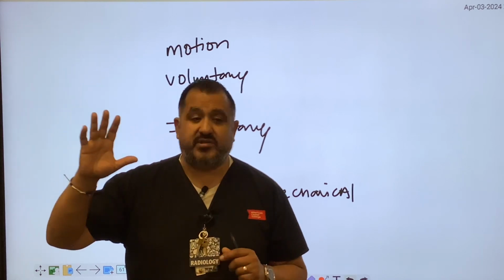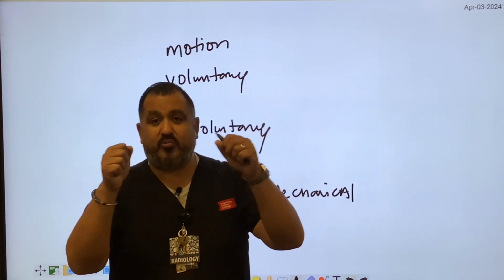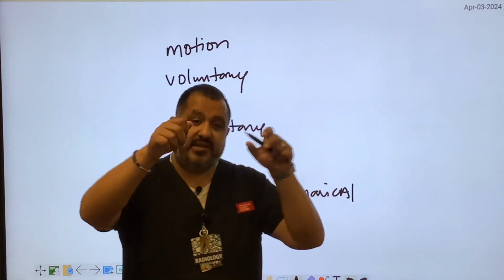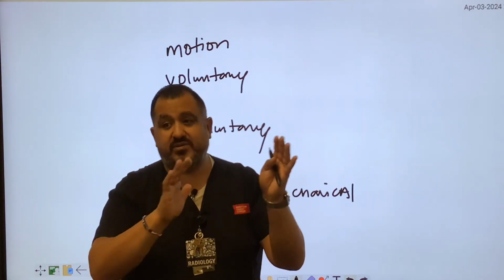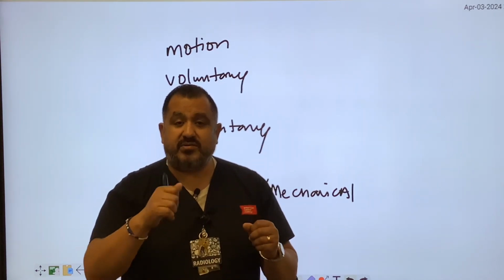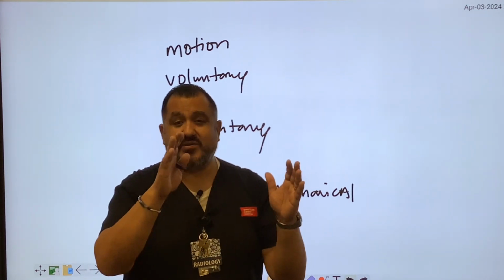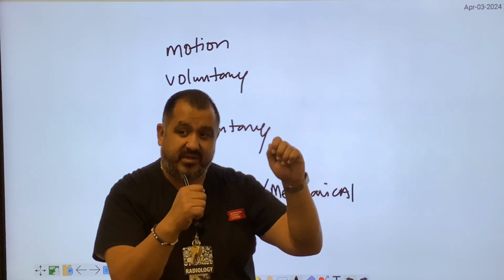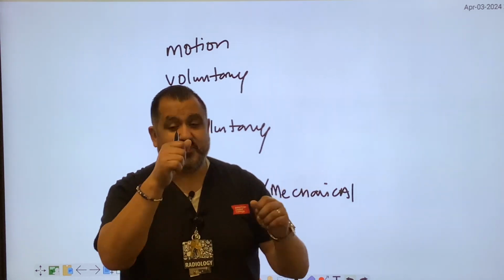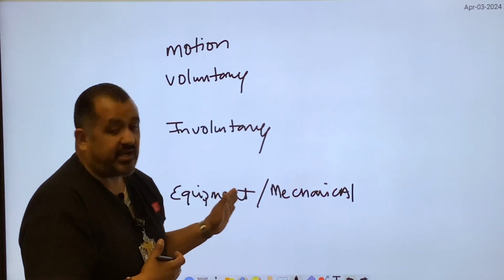Or if your x-ray tube, this is why I'm a big proponent of people using the x-ray tube locks appropriately, because if you move the x-ray tube without hitting those locks, it's going to slide, it's going to move, whether up and down or longitudinal, it doesn't matter. If you don't use the locks accordingly, it's going to strip the locks, and before you know it, your x-ray tube is going to move. If you have your angle perpendicular and it starts to swing down slowly as you're taking the x-ray, that's because the locks are stripped. So mechanical motion is coming from the equipment.